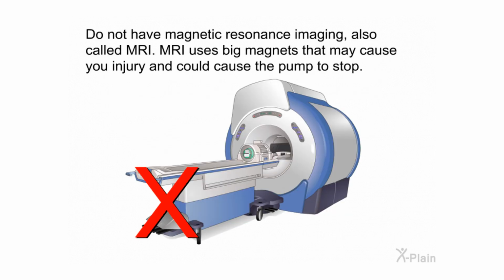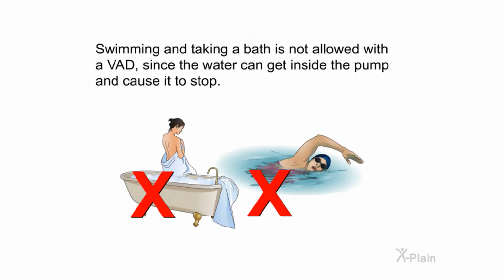Do not have magnetic resonance imaging, also called MRI. MRI uses big magnets that may cause you injury and could cause the pump to stop. Swimming and taking a bath is not allowed with a VAD since the water can get inside the pump and cause it to stop.